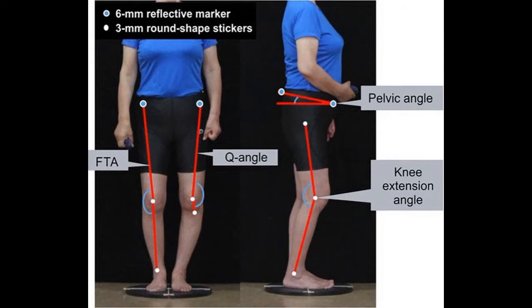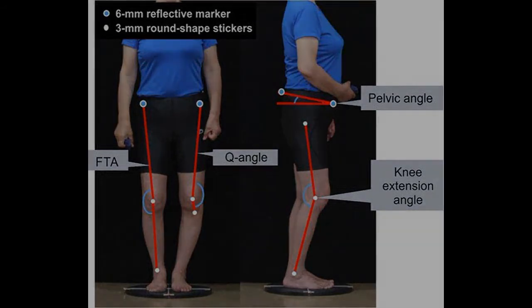Placement of reflective markers on the subject. In addition to the image, we will add heel and forefoot markers on our subject. We will collect 3 trials worth of data from each participant using an 8-camera Vicon motion capture system of Vicon, Denver, Colorado, USA, using a Vicon lower body plug-in gait marker set.